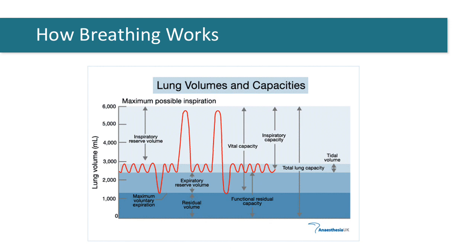I find it helpful to consider the various lung volumes while setting the mechanical ventilator because the tidal volume is distributed over a small proportion of the total range of potential lung volume. The ventilator is set to deliver a specific tidal volume, and depending on how positive end expiratory pressure is set, the relative end expiratory lung volume may be higher or lower.